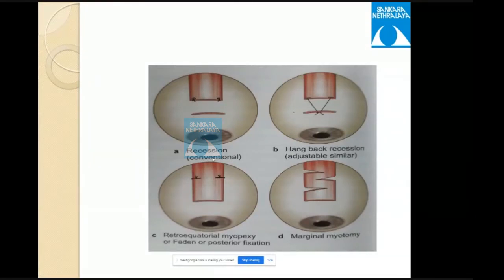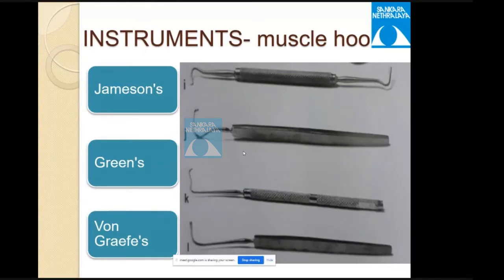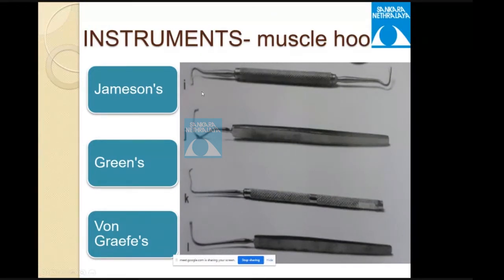About hooks: when first hooking a muscle, use the von Graefe hook (without a knob tip) since you are not yet sure you have the entire muscle. Once you have isolated the whole muscle and cleared the intermuscular septum and check ligaments, switch to the Jameson or Green's hook, which have a knob to prevent the muscle from slipping.